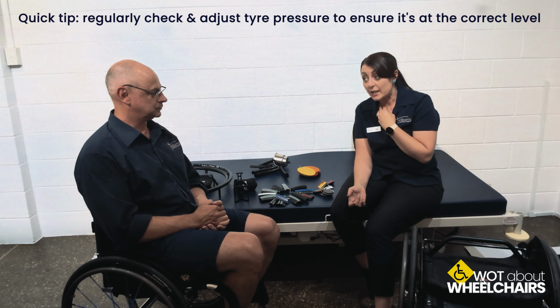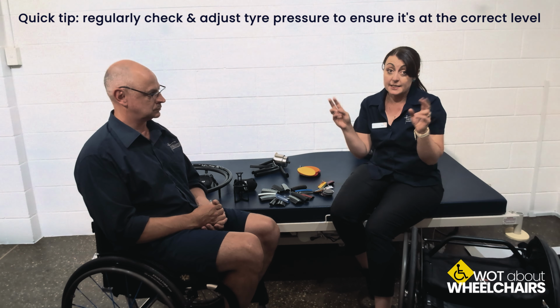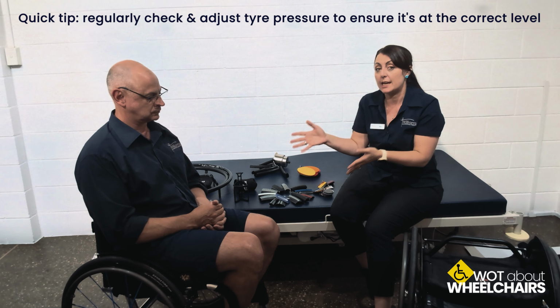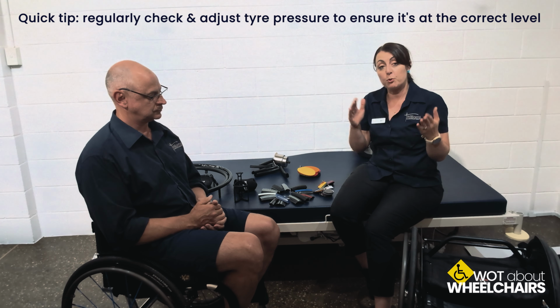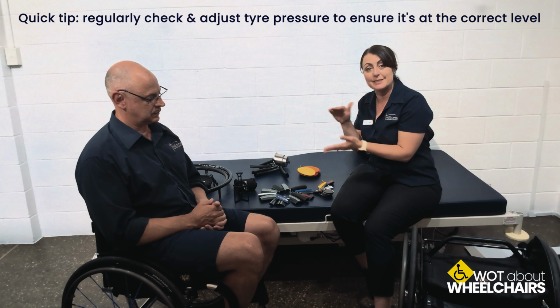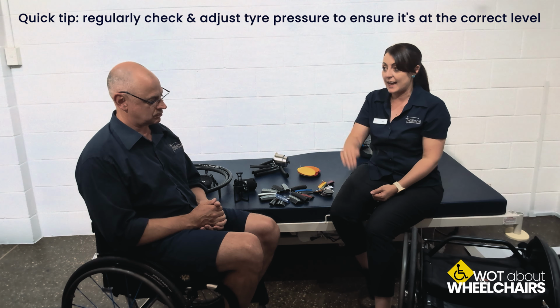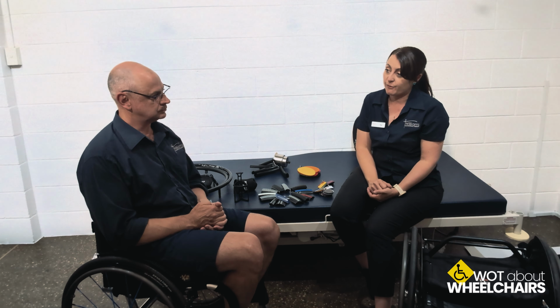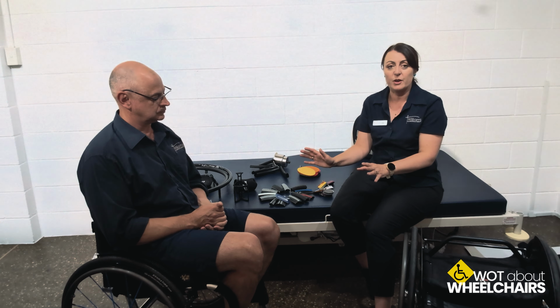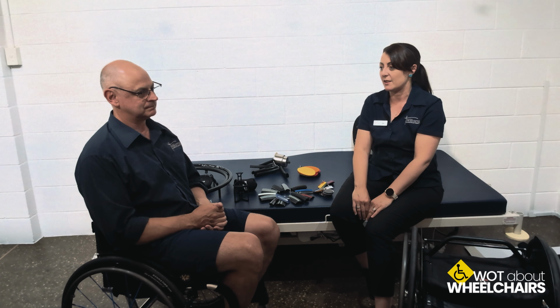What we like to do at Williams OT, when we do an assessment, we also will ask for a quote for annual maintenance, to keep your wheelchair in tip-top condition for as long as possible. So mostly NDIS will look at that recommendation, and they'll put some separate money into your plan for maintenance. And it is really important that annual maintenance is maintained, because otherwise, if a chair is used every day and it's not looked at for 5 years, all sorts of things start going wrong, which actually could have been prevented at very low cost, but all combined, it means that we have a real problem.